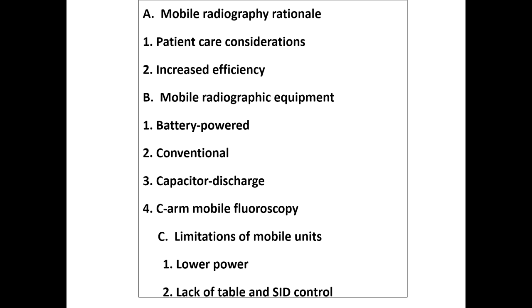If someone just has surgery and they're recovering in the recovery room, it's, you know, probably worthwhile to go do the portable there, right? So there's definitely good reasons for doing portables, but I think there are a lot of orders that are unnecessary. So, you know, another situation is if a person is in isolation, are you going to bring that person out of that nice, you know, air current controlled room and have them all over the hospital, right?